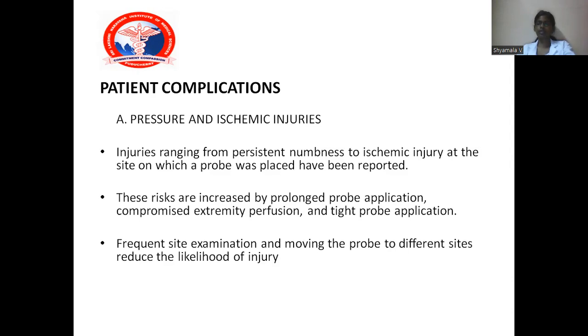Once the hemoglobin sites are occupied by oxygen molecules, the curve levels off again and becomes a plateau thereafter. The normal oxygen saturation lies between 90 to 100%, which corresponds to a partial pressure of 60 to 70 millimeters of mercury or more.